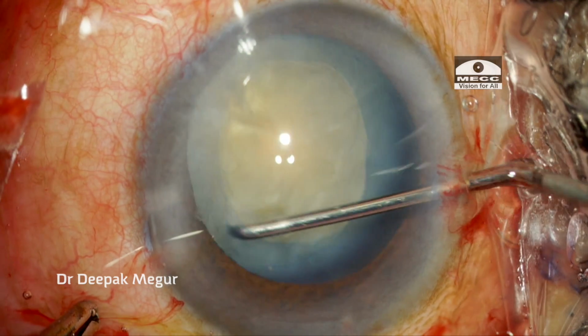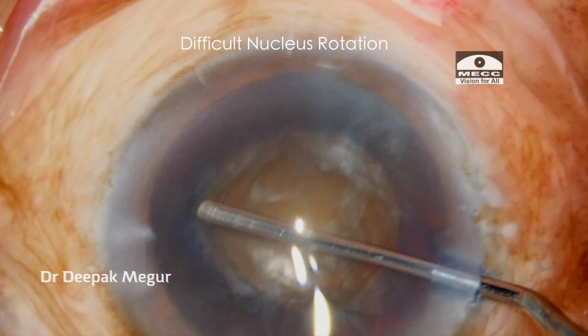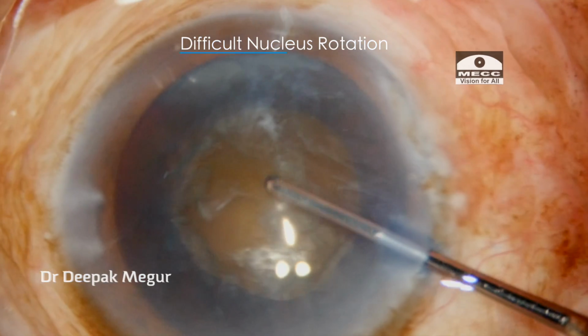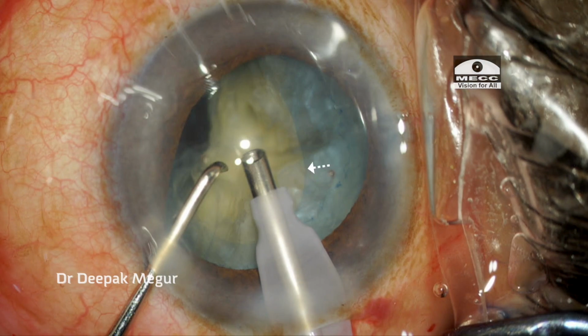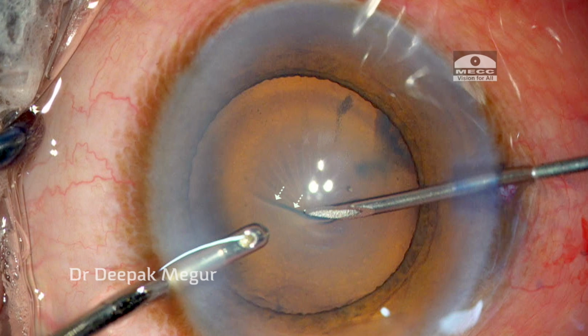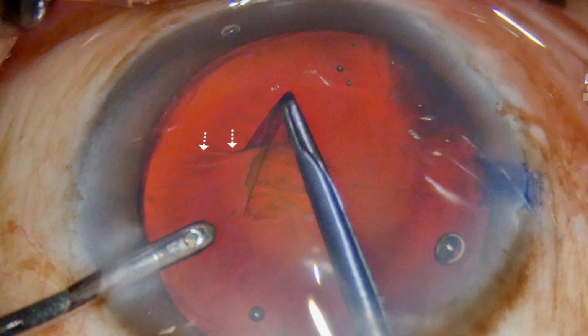Many times we realize that after hydrodissection, the nucleus rotation is difficult. In these clips, it is evident that the bag tends to be stressed during nucleus rotation. Another sign is when we notice that the rhexis margin loses circularity. It appears D-shaped. All of these situations warrant the insertion of a CTR.